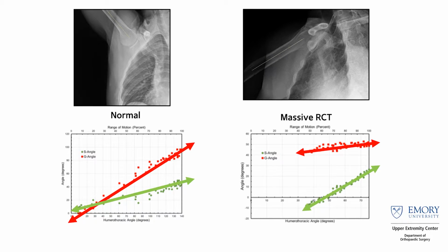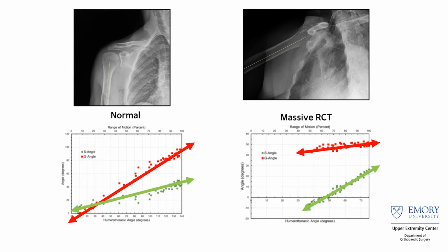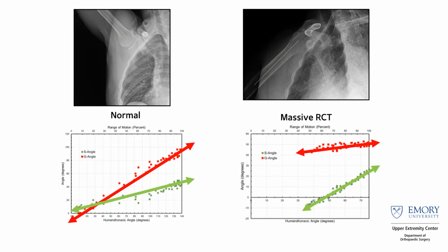So you see how much these patients are compensating, and how they can trick you into thinking that they have more motion than they actually do. Well, they don't really. It's really their scapula that's giving them this motion.